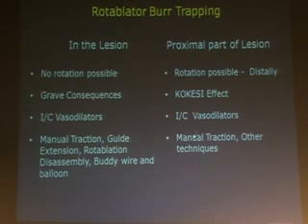Before I go into the details of why exactly it happened, I would like to emphasize that the majority of complications during rotablation, as available in the literature, are that the burr gets embedded in the lesion itself because it's not a proper rotation, or you're not taking care of pecking movement, or you are not taking note of the drop in the rotation. Because of the embedding, if you try to do a manual pull, it generally results in grave consequences.